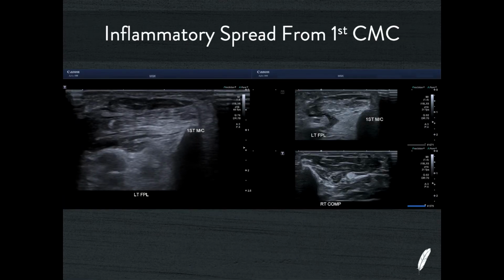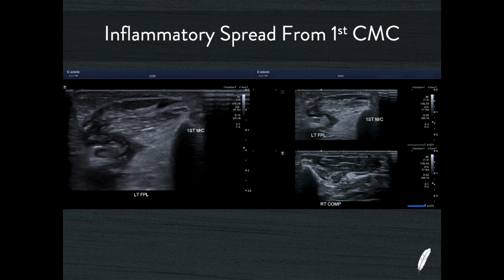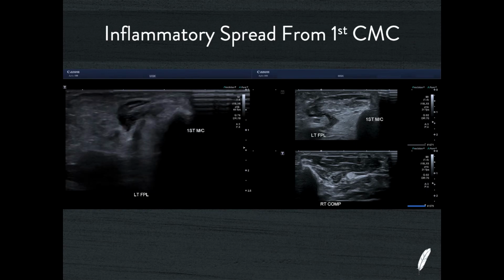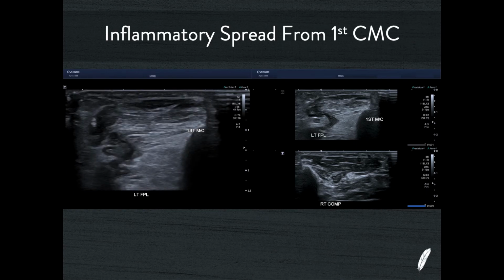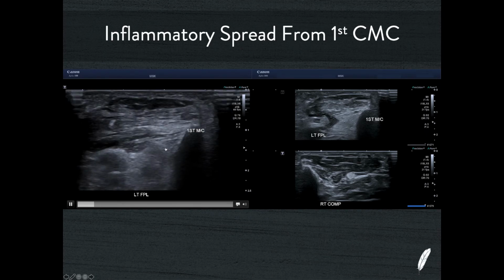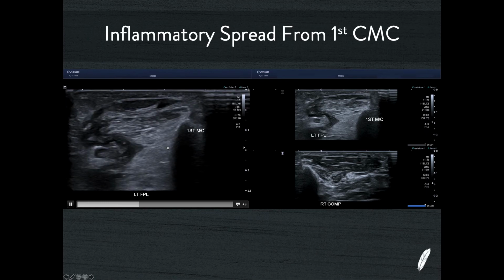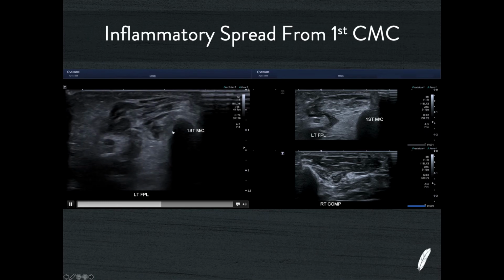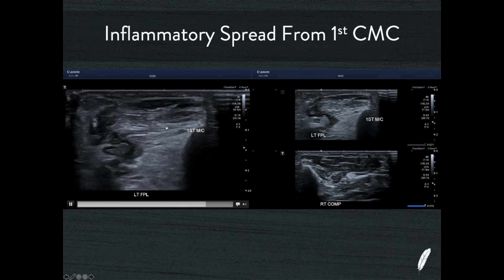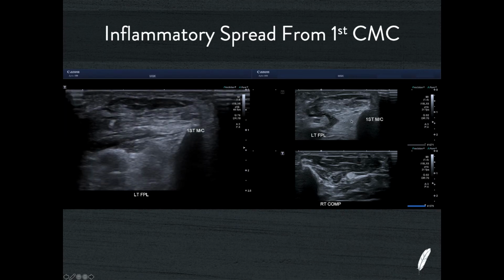Another thing that I notice in this part of the body around the thenar eminence is I have patients that present to me with a very tight, very tender, and quite swollen thenar eminence muscle group. And this is a really nice diagnosis. If you have a look at what happens here, they get first carpometacarpal joint osteoarthritis, and then they get synovitis of that joint. And then that inflammation spreads down the length of the first metacarpal shaft and involves the thenar muscles, making them echogenic and making them firm to touch and hypervascular.